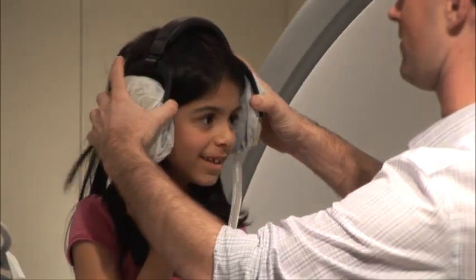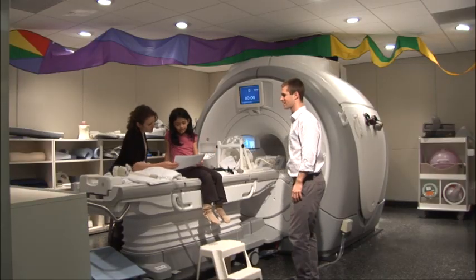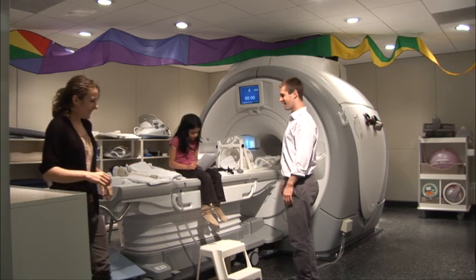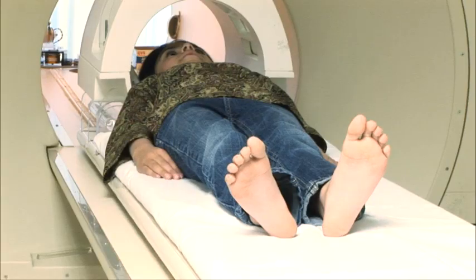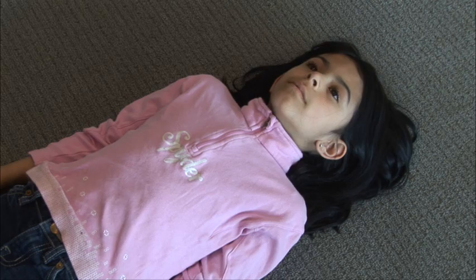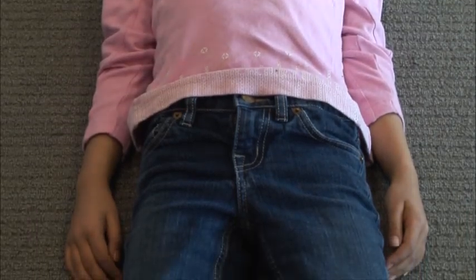When you are finished, you can take out your earplugs. We'll also print out a picture of your brain for you to take home. To help you prepare for your scan and to show you that lying in the scanner is not difficult, you can come in and practice lying still in a simulation of the scanner. This way you can see that it's pretty easy to do. You can also practice at home. We'll give you an audio CD and you'll get to listen to the MRI greatest hits while lying on the floor. We like to call this the statue game.